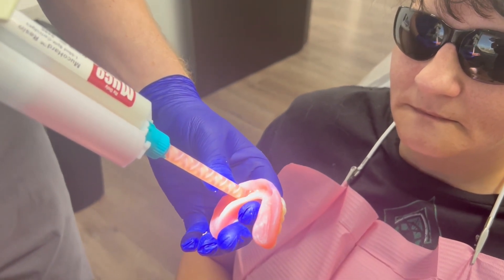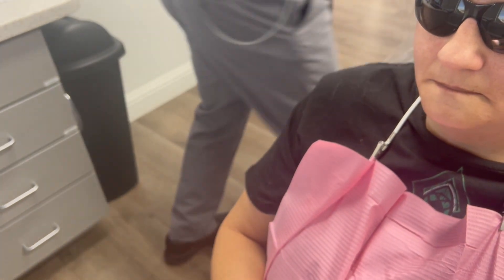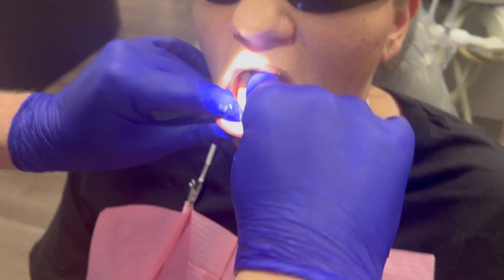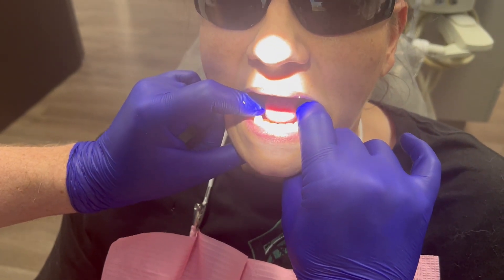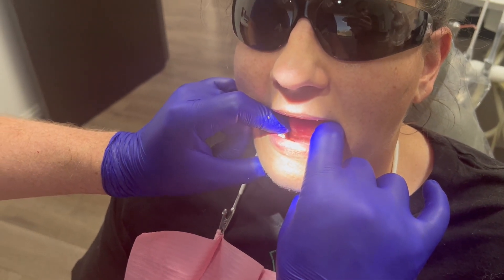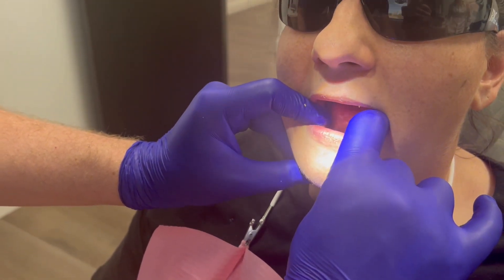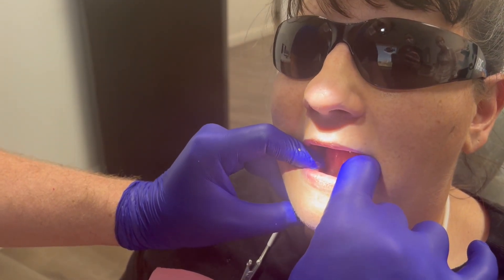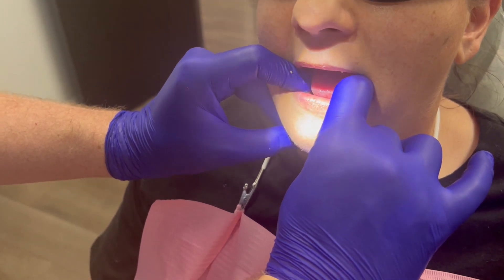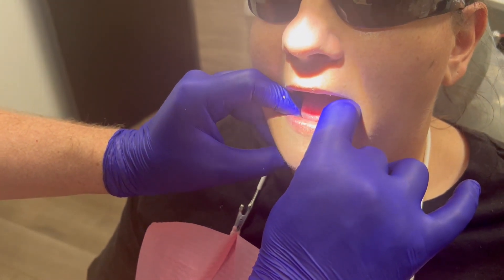I'm loading the hard reline material into the denture, and I have my lingual vents which is nice. You can see I have my custom block-outs. I'm coming in and going right down into the final configuration. This material can get hot, so I tell the patient: if it gets hot, let me know and I'll pull out immediately. The second it gets hot it also gets hard — that's why it's important to only do one at a time. On the lowers it's usually fine, but near the soft palate it can definitely get hot enough to cause issues.